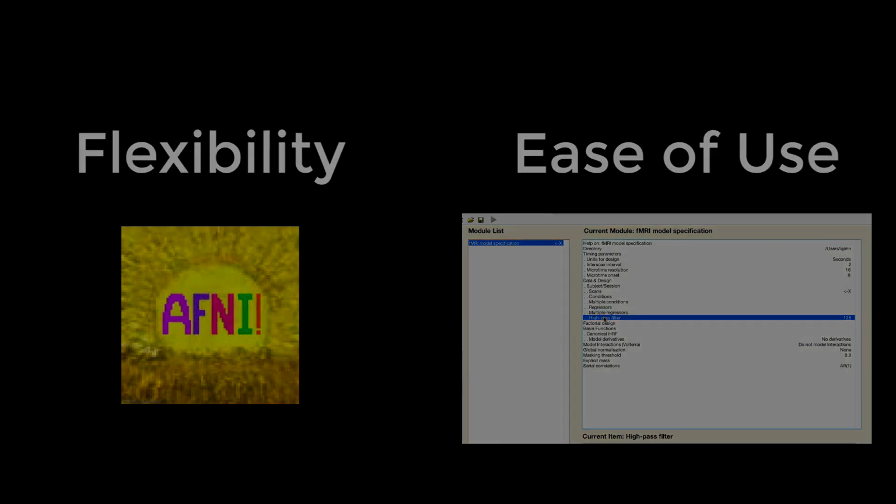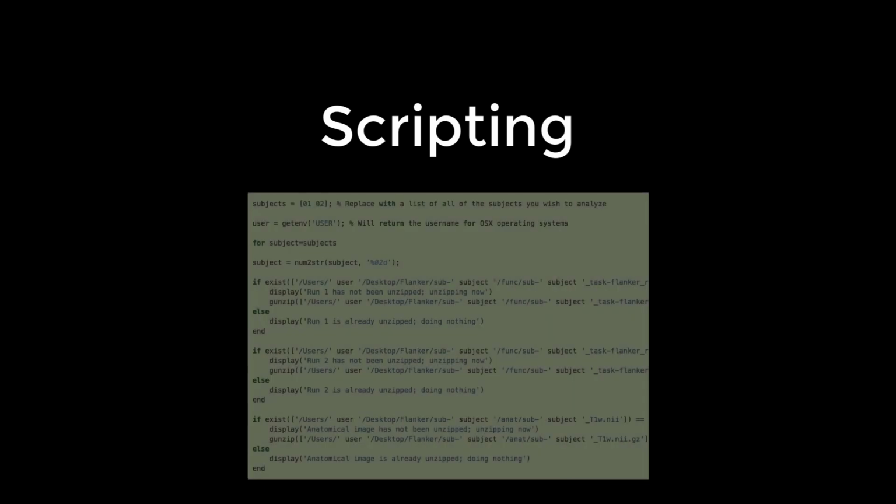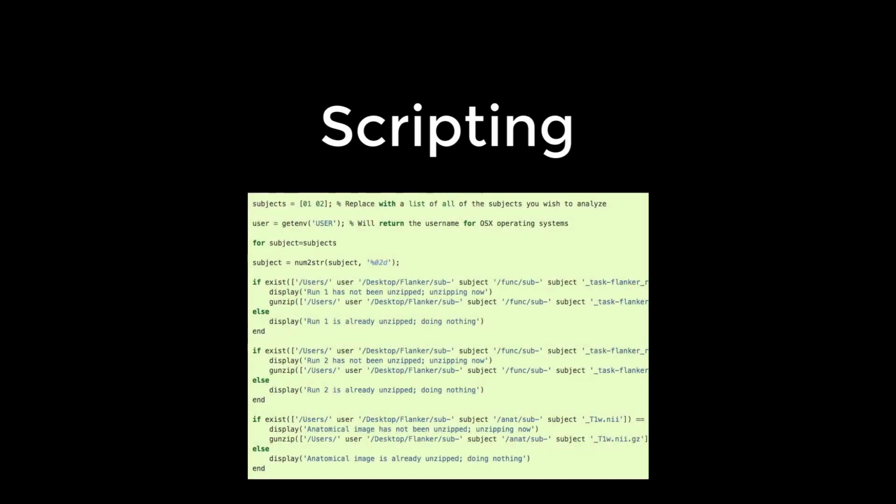There are some options that are available if you use the commands from the SPM library, although they can be difficult to use if you don't have experience with coding. As we learn more about the basics of SPM, we'll eventually learn how to code our analyses or script them in order to save time and minimize the chances of making a mistake.